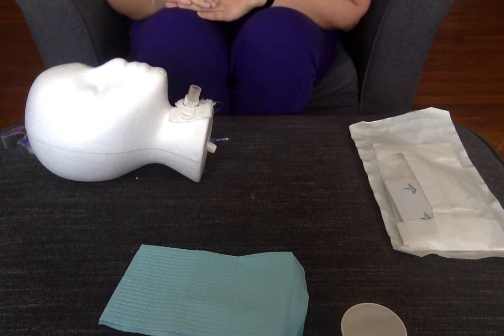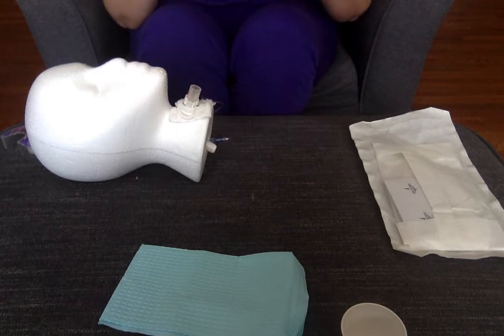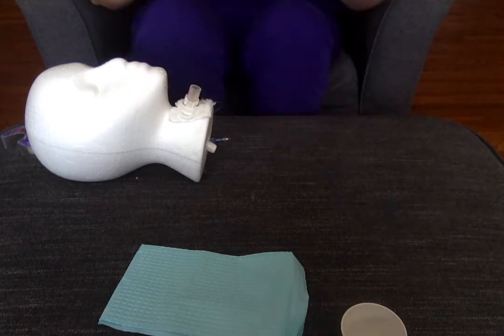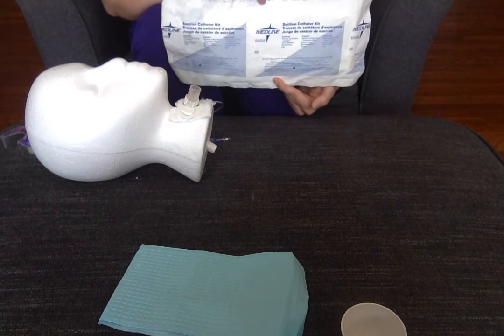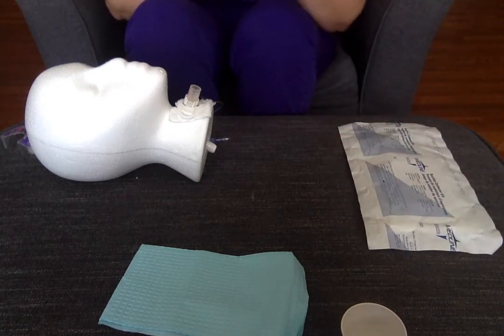Hi guys, this is Professor Sears. We're going to go over some tracheostomy care so you can see it a little more close up, and we'll go through the steps of the actual skill so you guys can use this as you're studying. I've got my mannequin with the tracheostomy tube here, and I do have a package for a suction catheter kit. This is not quite the one that you have, but it looks very similar. There's a lot of stuff that you have to prepare and set up before you even come into the room.